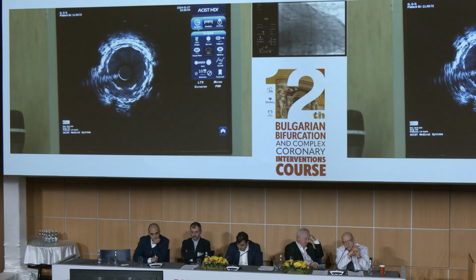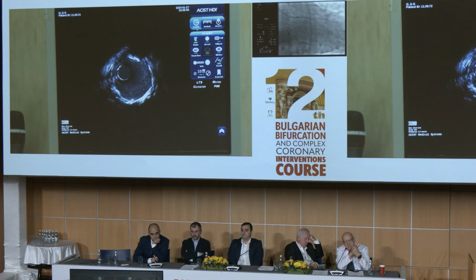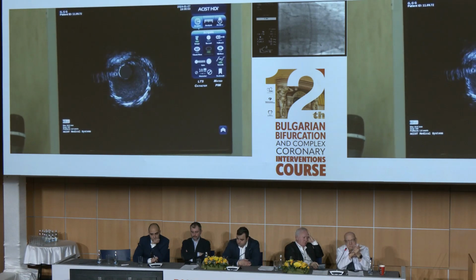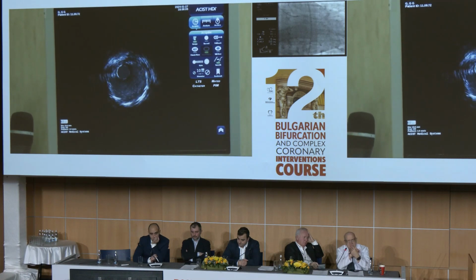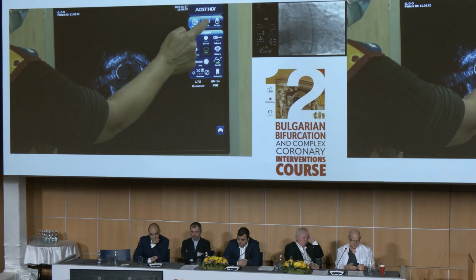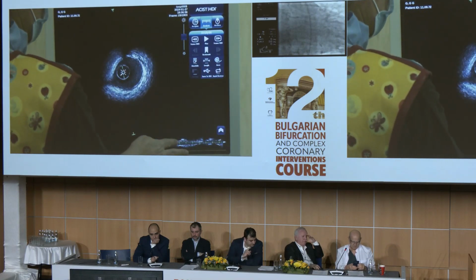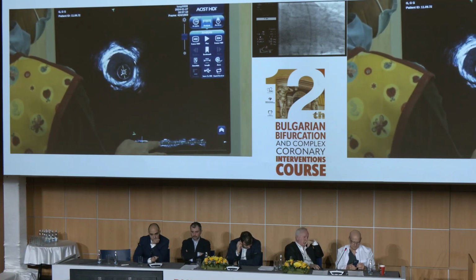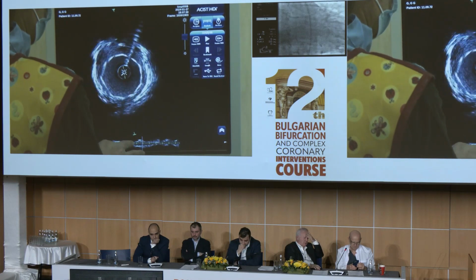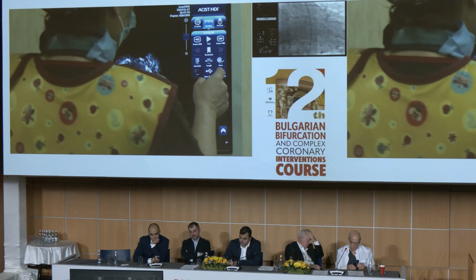Here you have a very good position of the stent. And how long is this segment? It's practically no more than 5 millimeters. Yeah, I think that's reasonable. More wise to leave it. No more than 5 millimeters. Just to check. Okay, Eva.